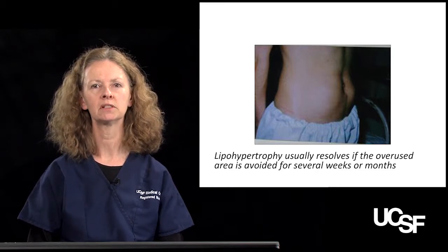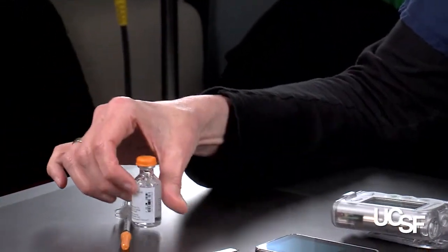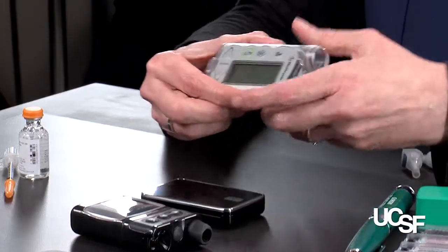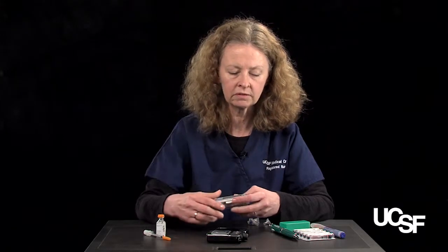the insulin pumps. All right, so as I mentioned, I'd like to show you some of these insulin delivery devices. The first is the vial and syringe. Everybody has seen that, no mystery there. The next thing I'm going to show you are the insulin pumps, and then we're going to move to the insulin pens. So this is just a smattering of three of the different pumps that are available out there. There are several others that are also available.